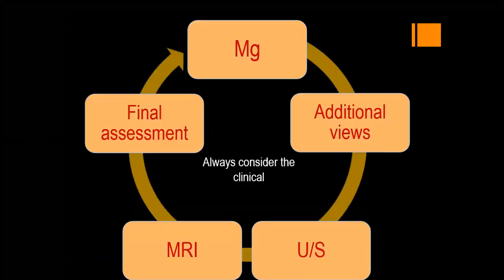And in conclusion, we have to do mammogram for screening females above 40, and for diagnosis of palpable abnormality in their 30s. Or if she's young and we have done ultrasound and we find suspicious findings, and it is proven to be cancer, then a baseline mammogram will be performed.